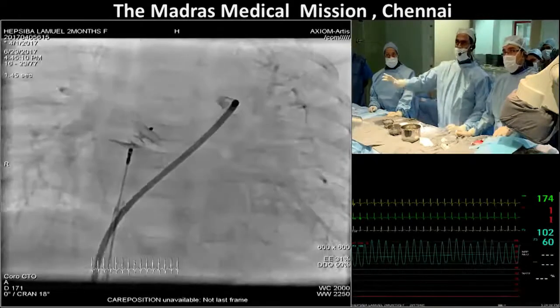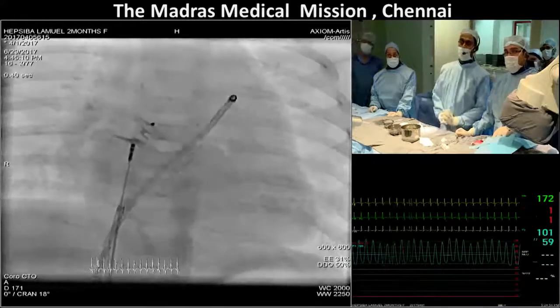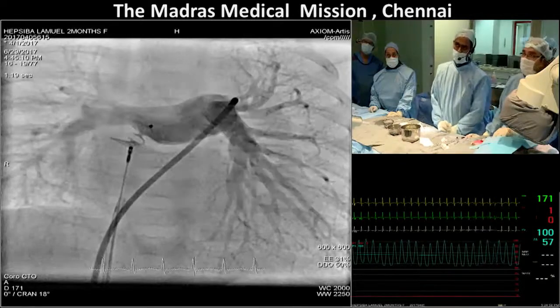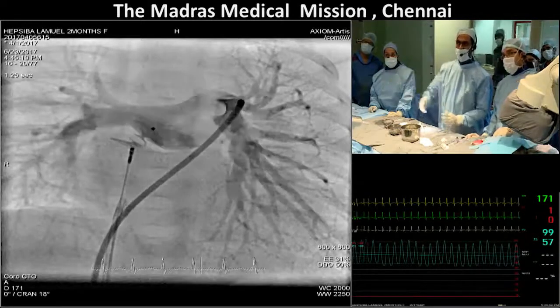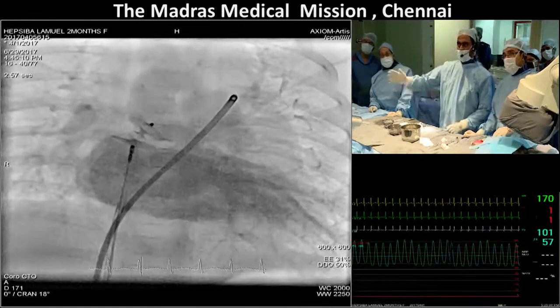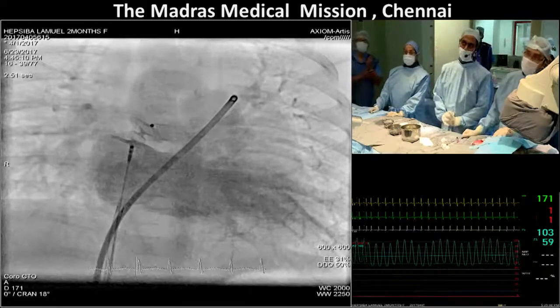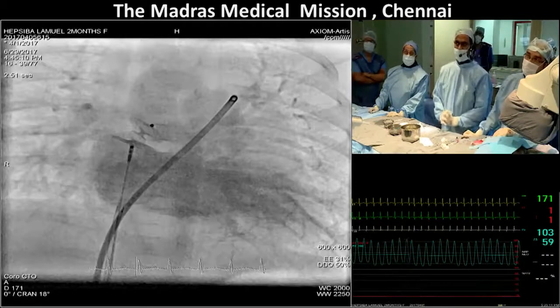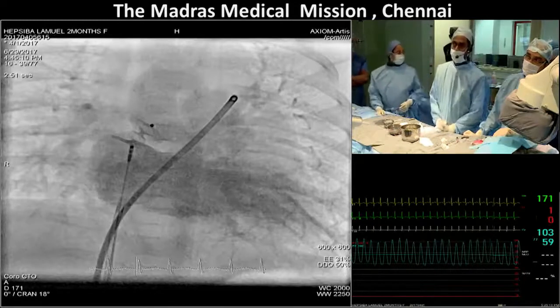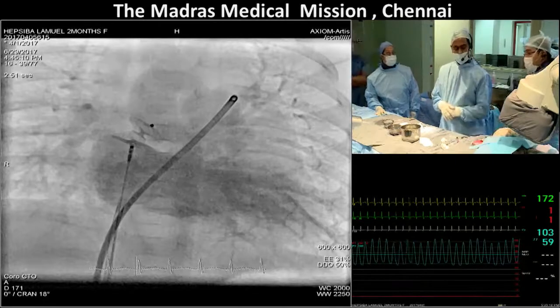So freeze it. So the pulmonary artery side seems to be well opposed, and go to the levo phase, freeze it, go back. The left atrial side also seems to be okay. Positionally we feel that we are reasonably good. I would certainly agree with that.